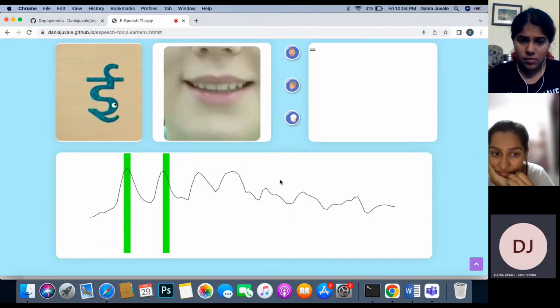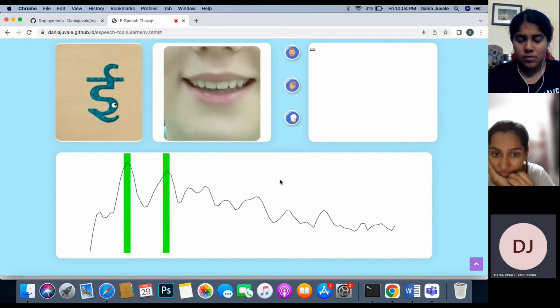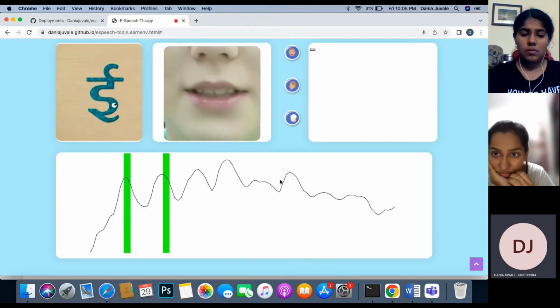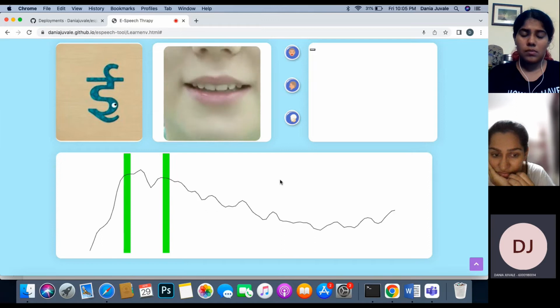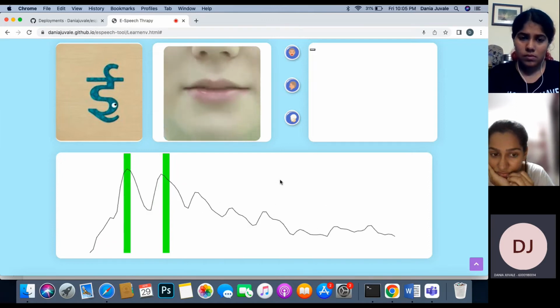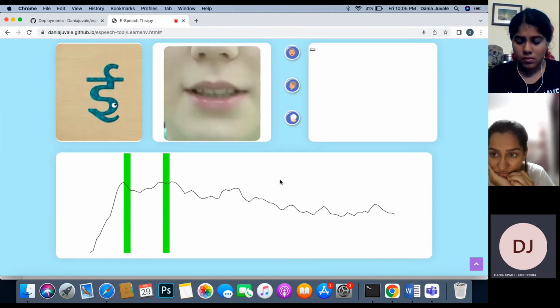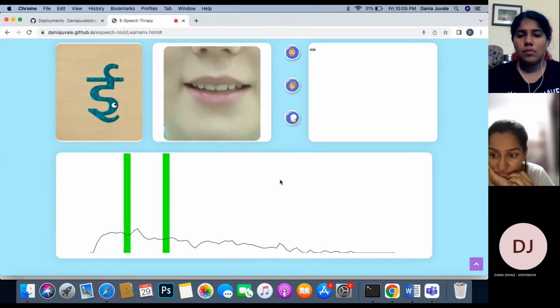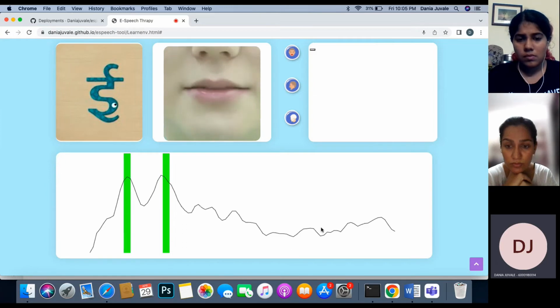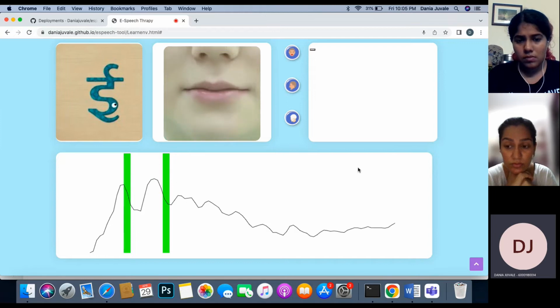For the formant extraction part, we have used LPC. For face detection through video, we have used Haar Cascade. For the lip detection part, we have used the Dlib library for facial landmarks. And finally, for the detection of E through lips, we have used the LipNet architecture to train our model. As you can see, a lot of waves are generating here, which is essentially because of the noise in the background. I will show you the demonstration now.